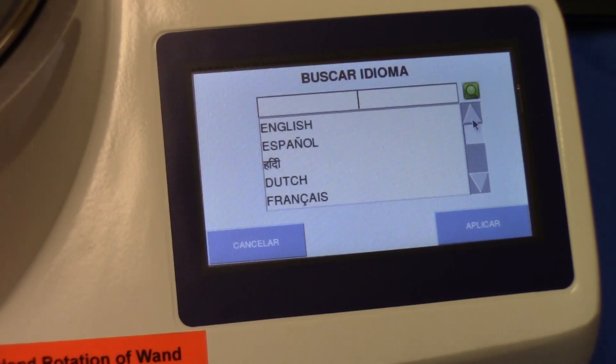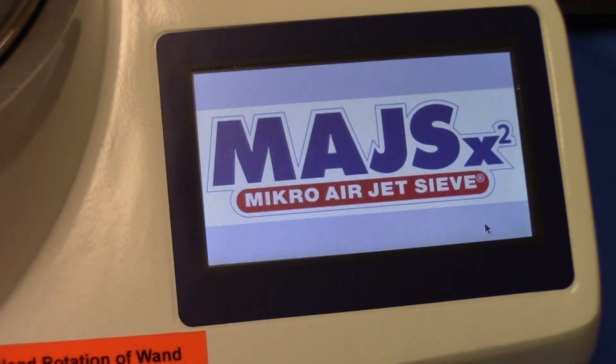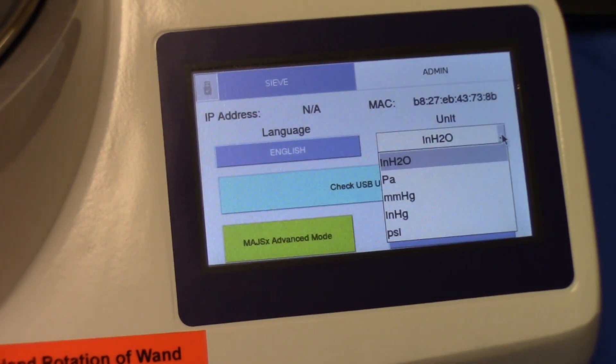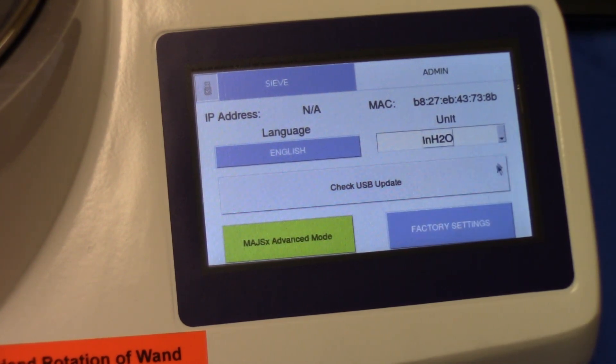Back to the admin page in English. Outside the US, it's common to use different units of measure for the vacuum pressure. You can select from: inch water column, Pascal, millimeter mercury, inch mercury, or PSI. Simply highlight the appropriate one and you're ready.